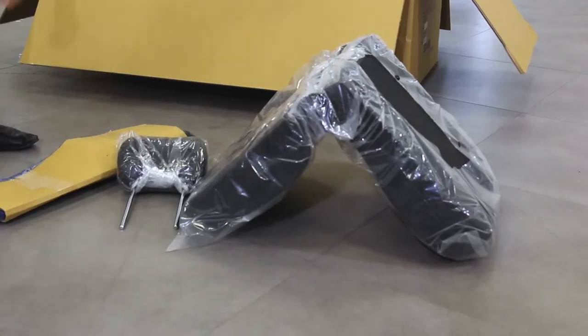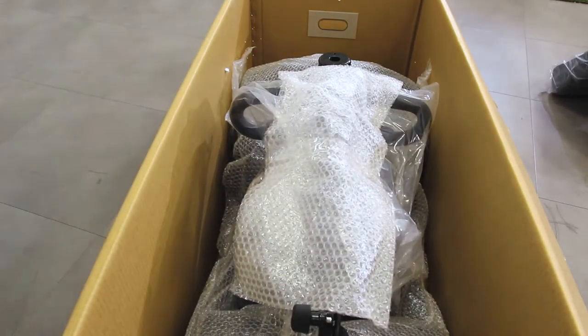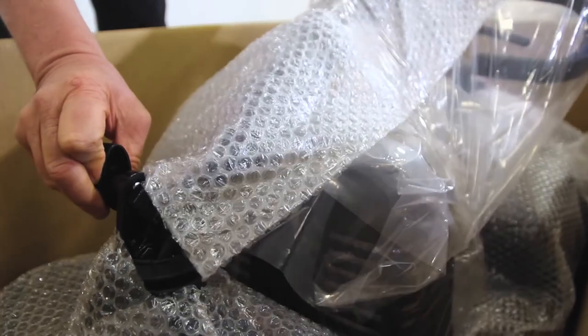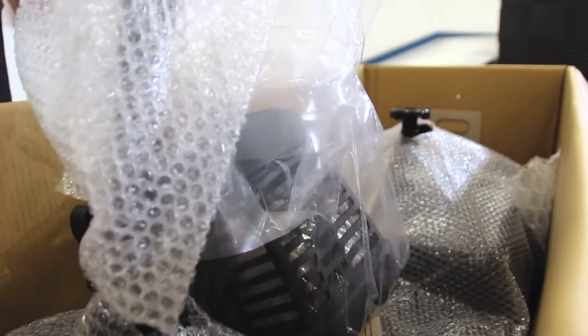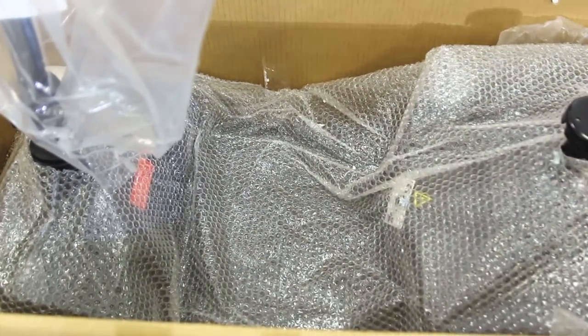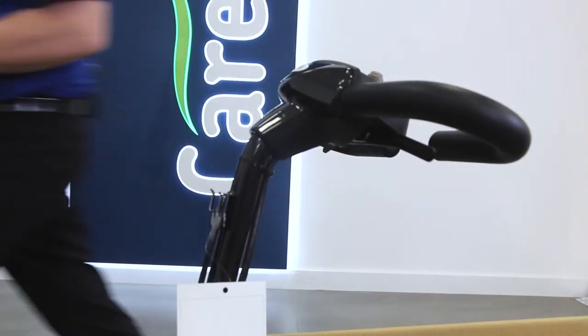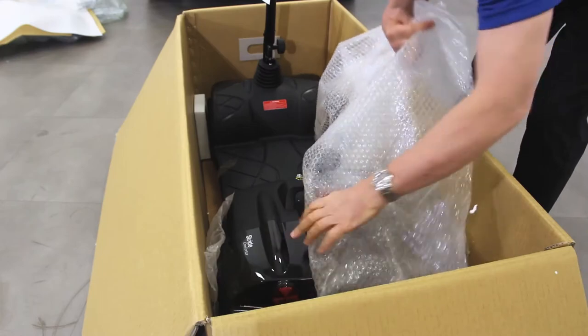To remove the main scooter body you'll need to raise the tiller first. Unlock the tiller by twisting the dial at the base. Cut off any tape holding the tiller down, then raise it by lifting from the handlebars. Release the dial so the tiller locks in an upright position. Cut away and remove any remaining plastic wrapping from the tiller head and the main scooter body.